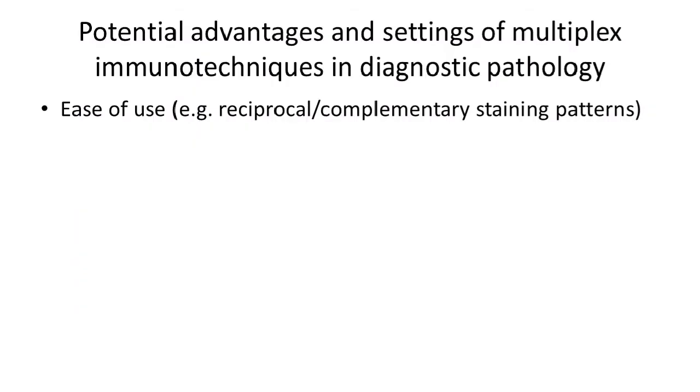So it's always important to go through a process of validation of the various antibodies which are eventually included in the multiplexing imaging, by using them in a single-plex approach to see whether they perform as well as you would expect from any single-plex stain. That goes for all of these different techniques.